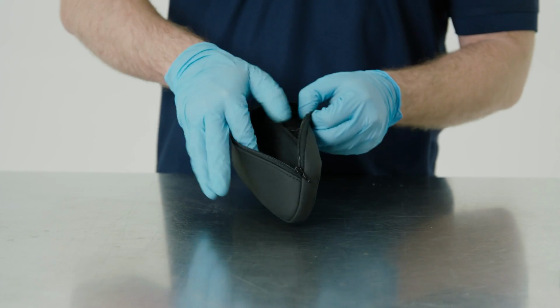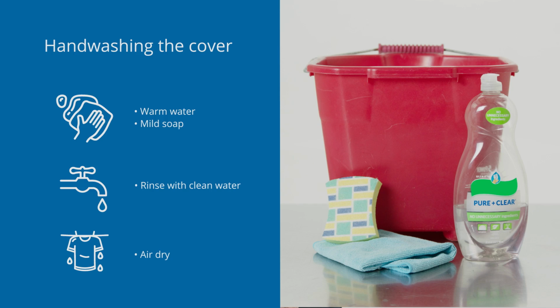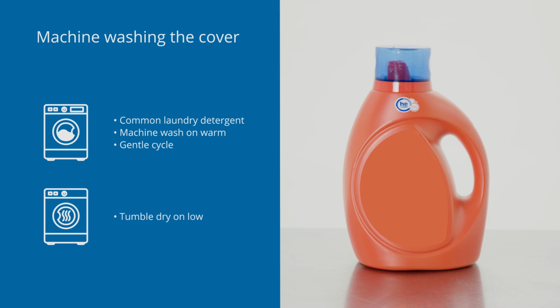For cleaning the covers, remove inserts from the covers first and hand wash in warm water with mild soap. Rinse thoroughly with clean water and air dry completely before use. Alternatively, machine wash the cover in warm water with common laundry detergent. Tumble dry low. Remember not to steam clean, autoclave or iron the cover.